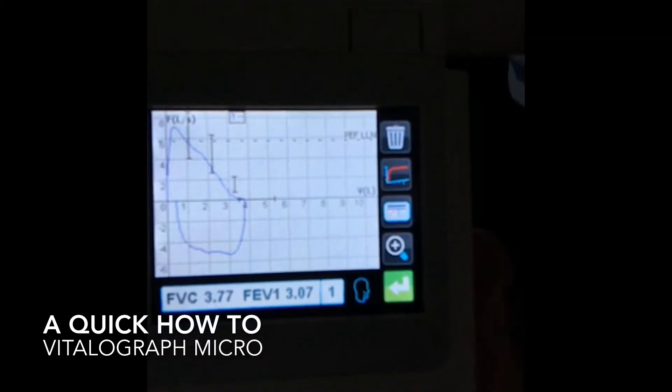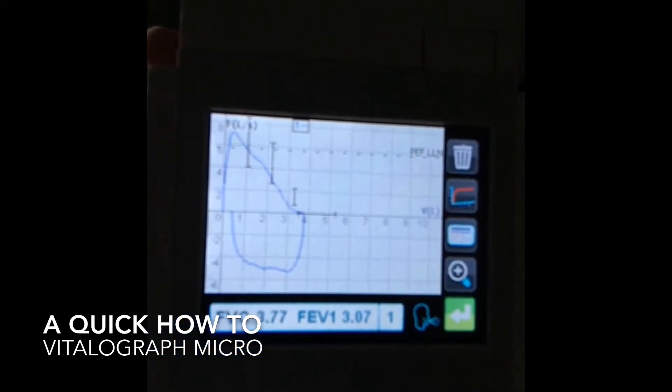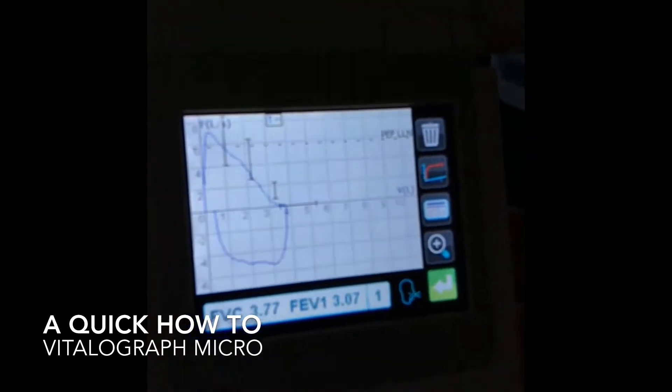All right, so you see that I have a number one there. Again, I apologize that my screen is backwards, but you can see that I have a number one there. And so that effort was acceptable by minimal ATS requirements. So we can go ahead and blow again.